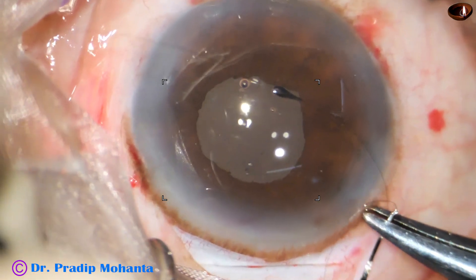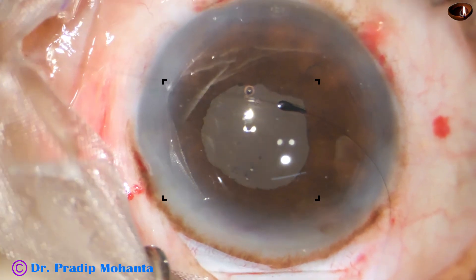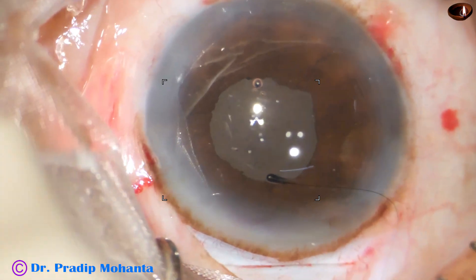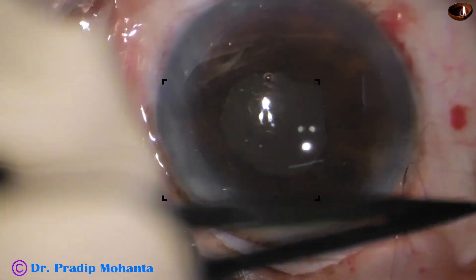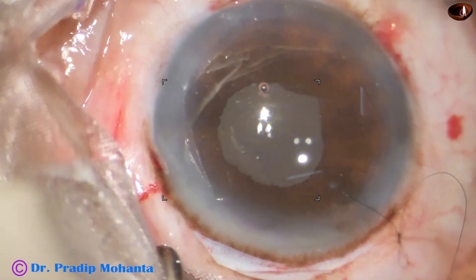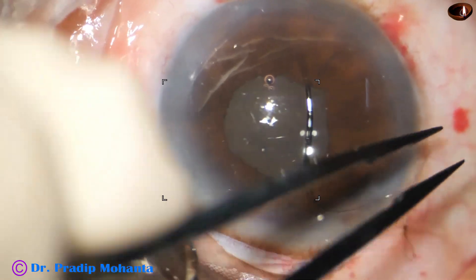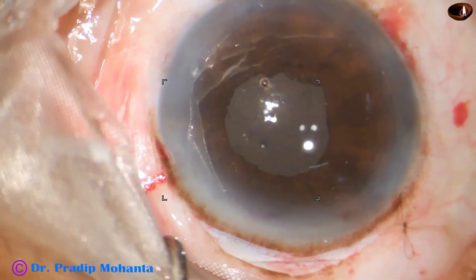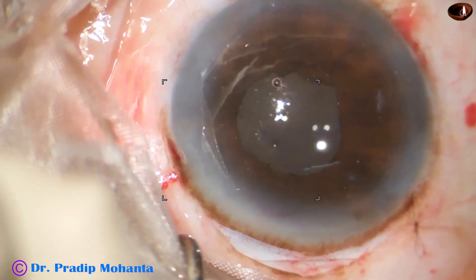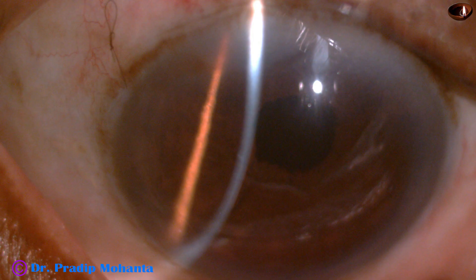But I have to oppose the conjunctiva to the limbus very nicely. So I take a 10-0 nylon suture and do a releasable suture. If we use bipolar wet-field cautery, there is burn and it is not foolproof — there is a lot of scarring and bad appearance. But if we do a releasable suture like this, healing is very good. Looking at the post-op pictures: see the opposition of the conjunctiva to the limbus — how beautiful it is. There is a releasable suture and the cornea is absolutely clear.